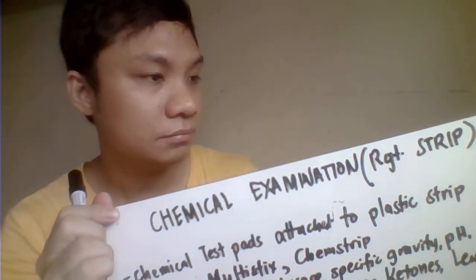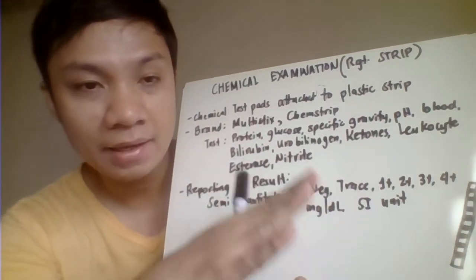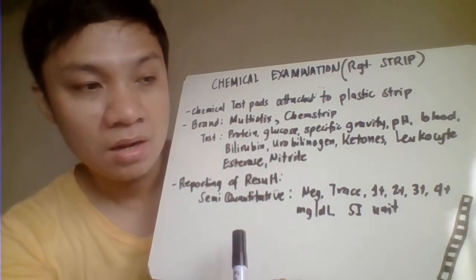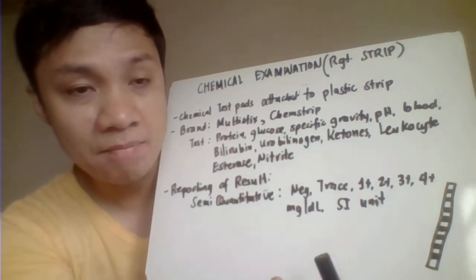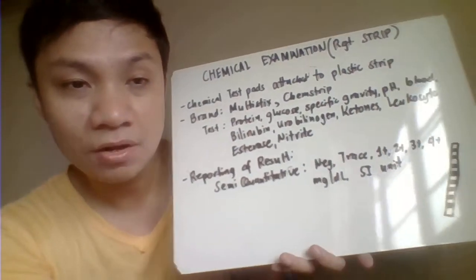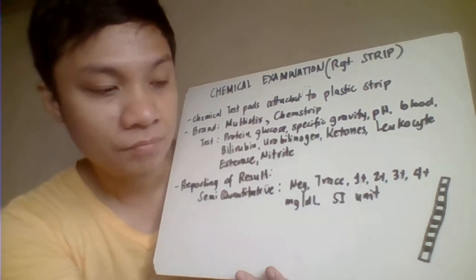On the other hand, pag sinabing negative side, itong side ng test strip natin na walang reagent test pads, yun ang ibablat mo sa tissue paper. Okay, so do not blot the area kung nasaan ang ating mga reagent test pads, because if you try to blot that, magkakaroon ng discoloration. Remember, this is a color reaction. So kung ito ang side na may mga test pads, dito ka magbablat o dito mo i-wipe ng tissue natin.